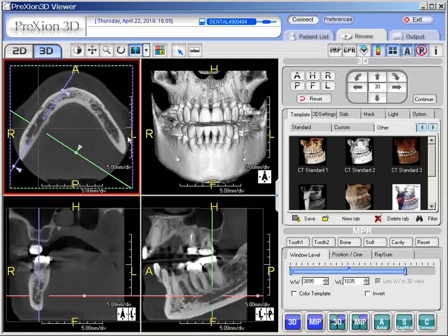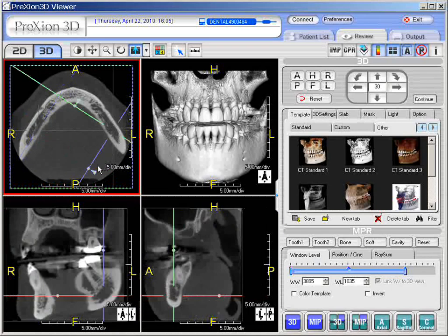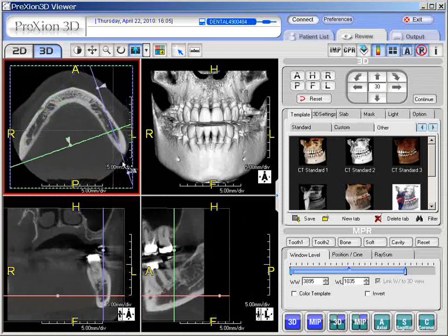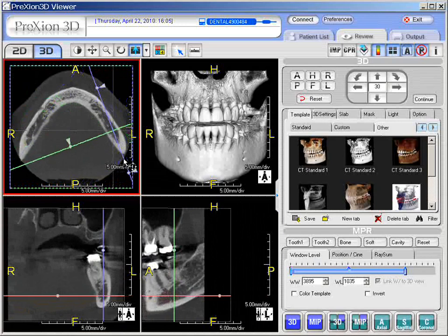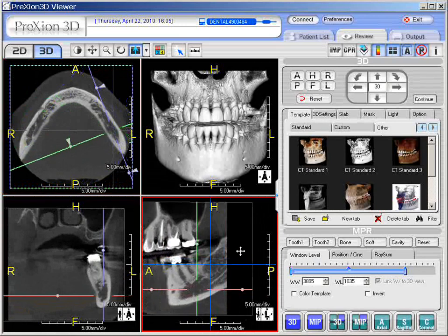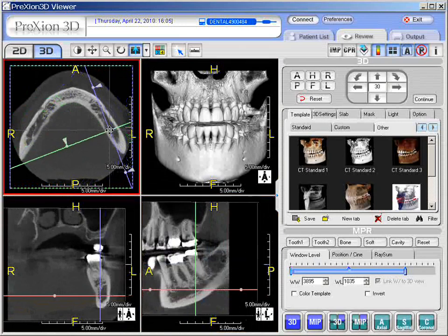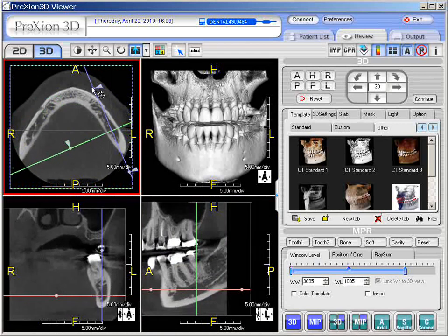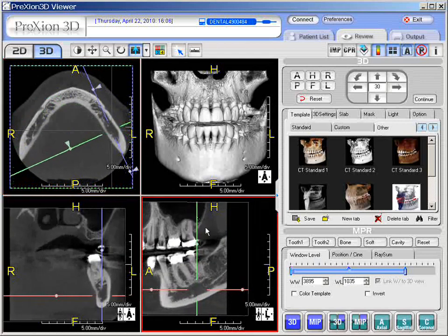If we were looking at the left side, we can quickly go there. Here we find the mandibular canal. I'm pressing the Alt key, left clicking it — I'm just going to take my blue line and put it parallel to the left side. Once we do that, we can find the mandibular canal on this particular side. I'm going to right click to center this. You can also move this buccal-lingually to get a better projection and oblique from the anchor point to make a more elongated view, getting a nice, beautiful view of the mandibular canal in this projection as well.